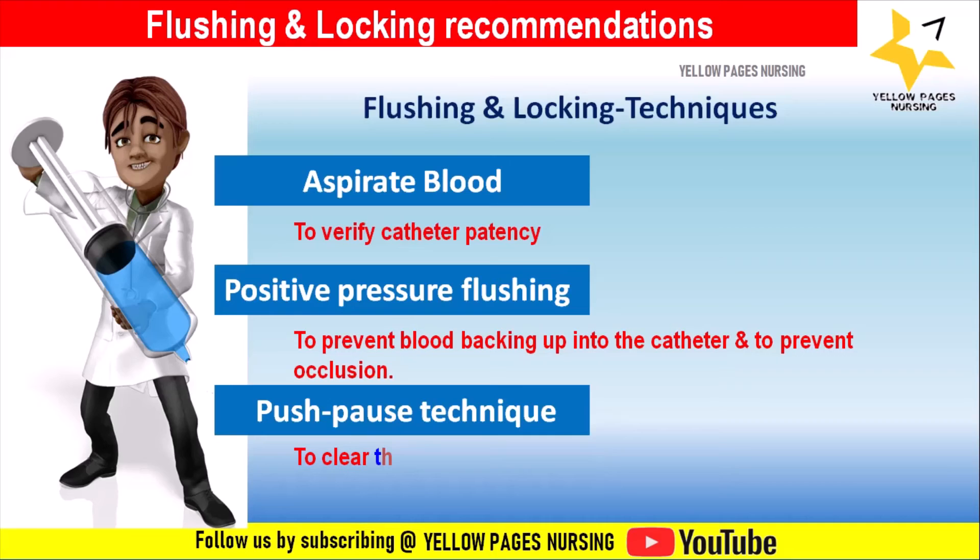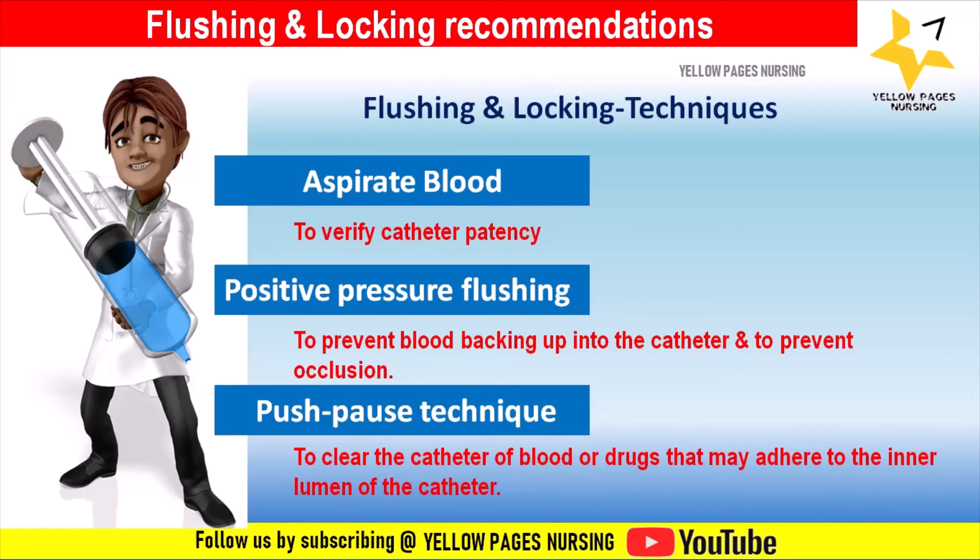The push-pause technique is a turbulent flush using a rapid stop-start or push-pause motion. It is designed to clear the catheter of blood or drugs that may adhere to the inner lumen of the catheter.